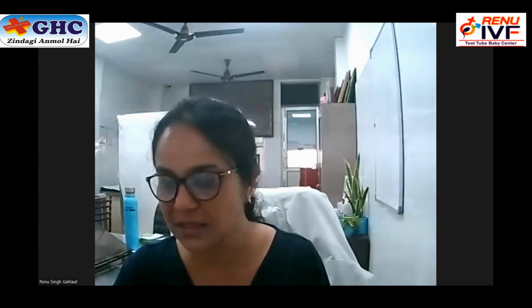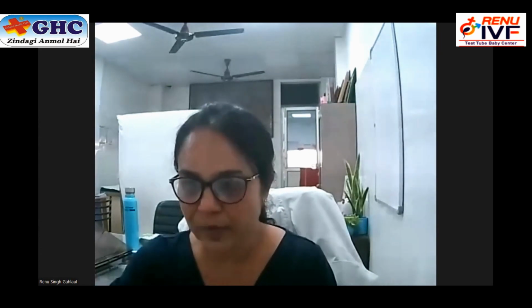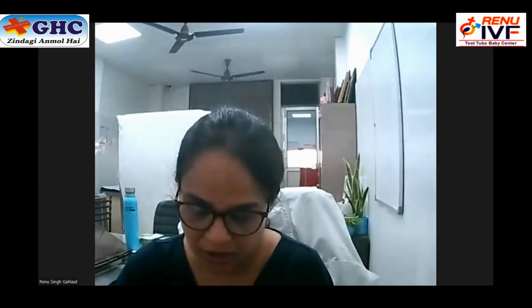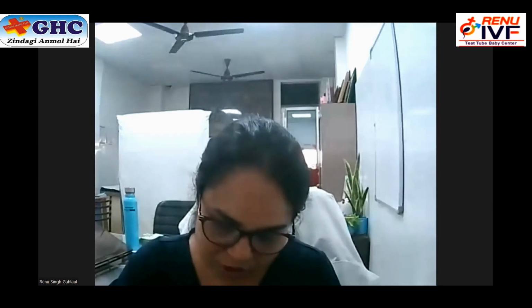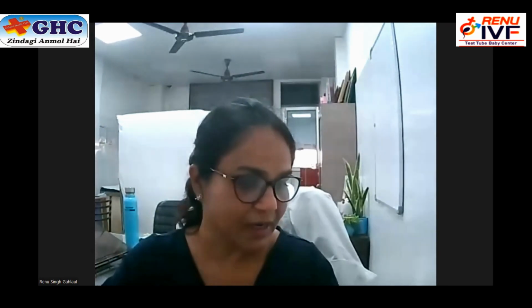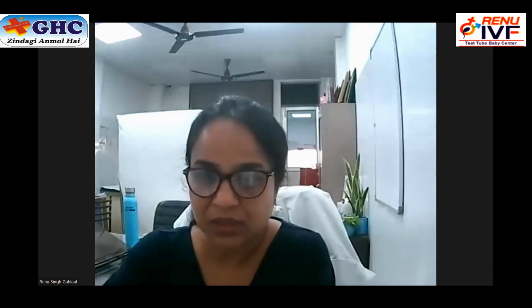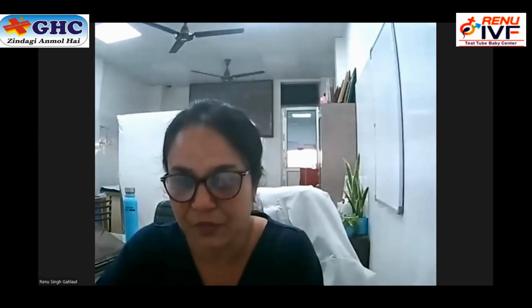And another important thing is OT की cleaning is equally important. It's not just कि instruments को हमको ध्यान देना है, OT के instruments, OT की trolley, OT की wall, floor, roof, पूरा wash करना, पूरा उसको अच्छे से deep cleaning is actually very very important on regular intervals depending upon the load of surgeries which we are having and type of surgeries which we are using. So this is again very very important thing. Everyone must be having the protocol, and that protocol should be strictly followed.